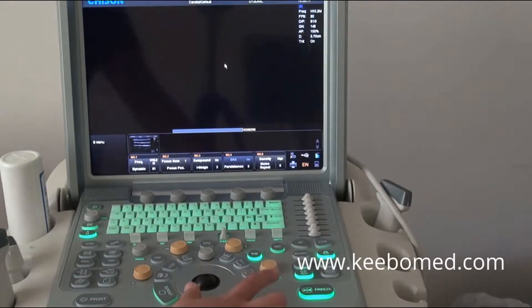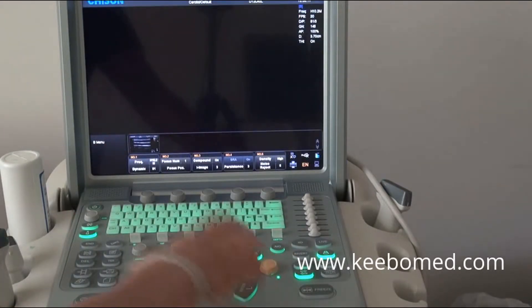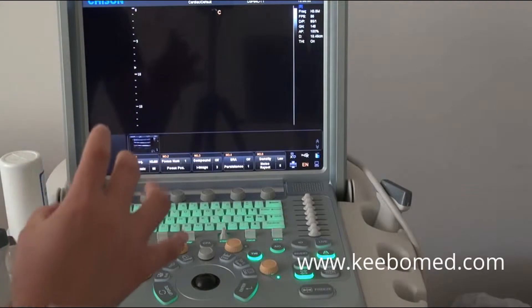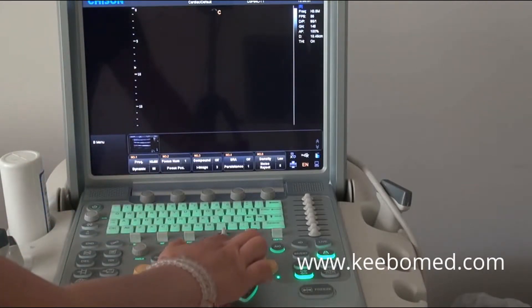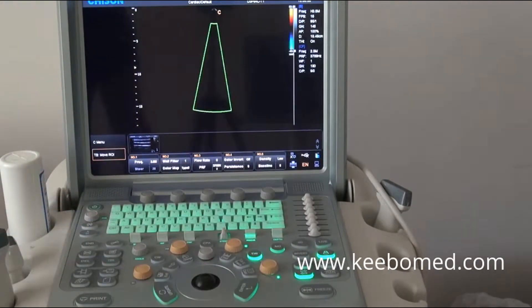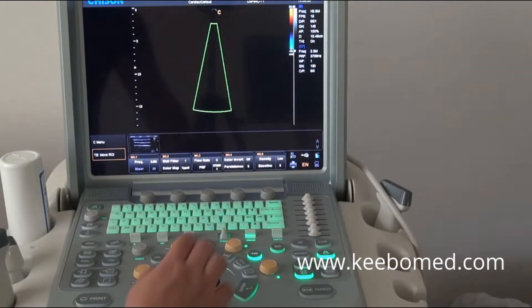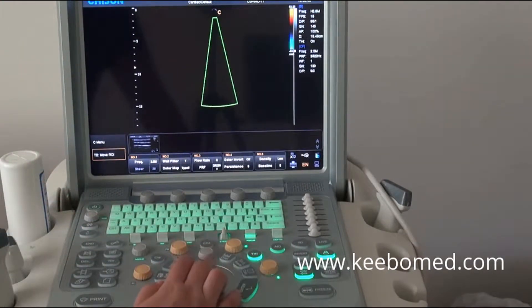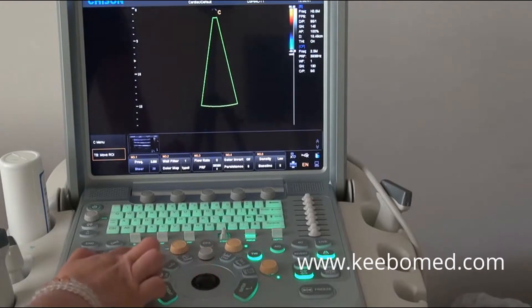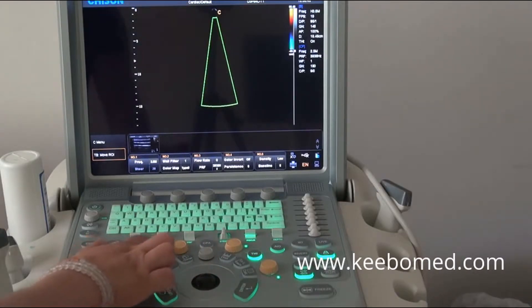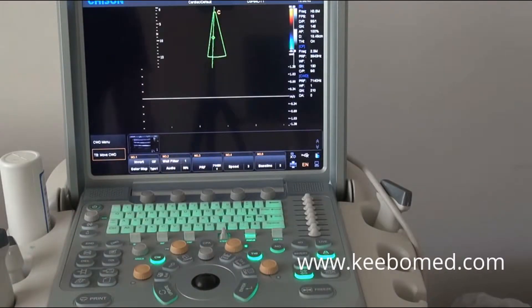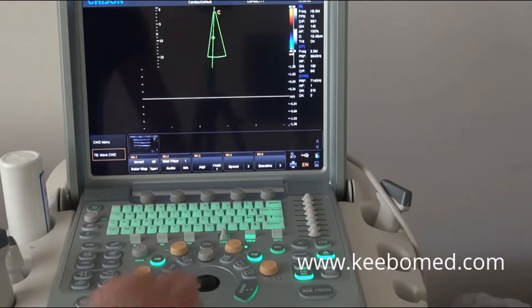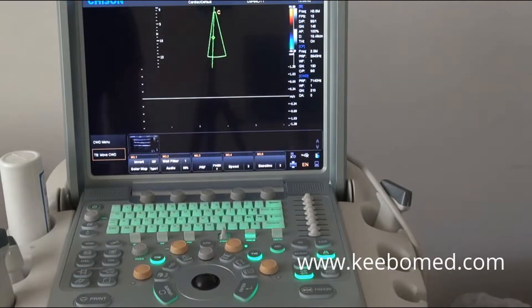In B mode, first of all, you want to go to the CW mode. Press the C key to go into the color mode, and then press the CW key to go into the CW mode. Press the update key to get the spectrum.